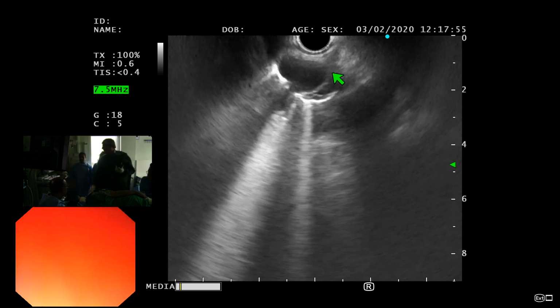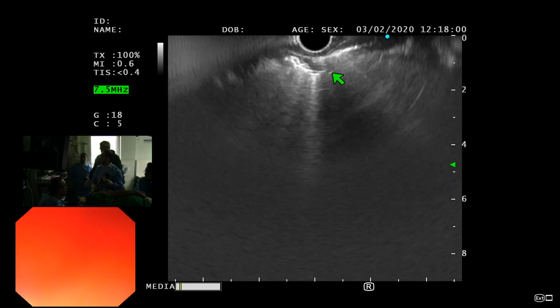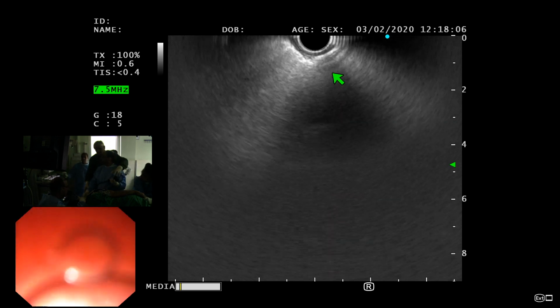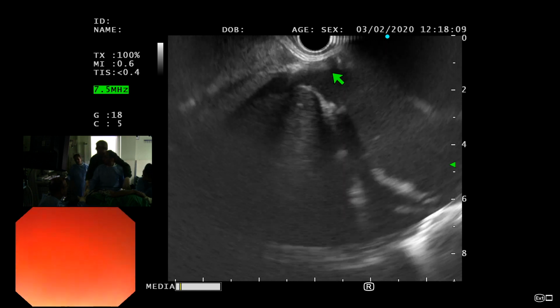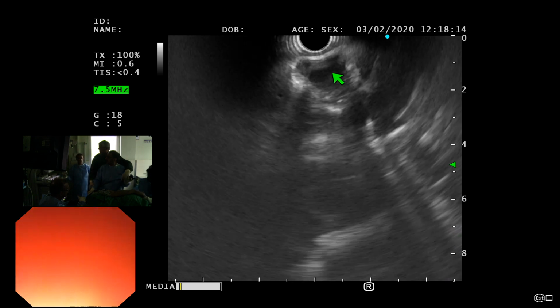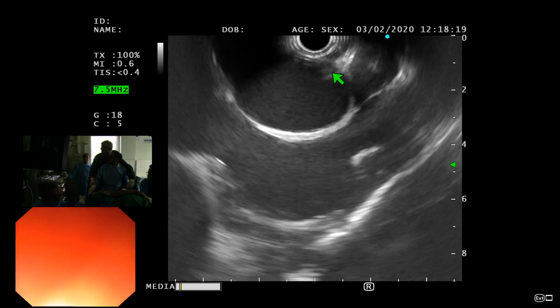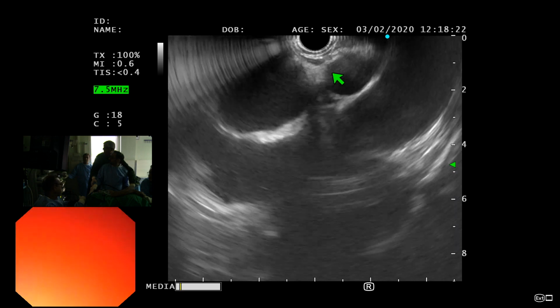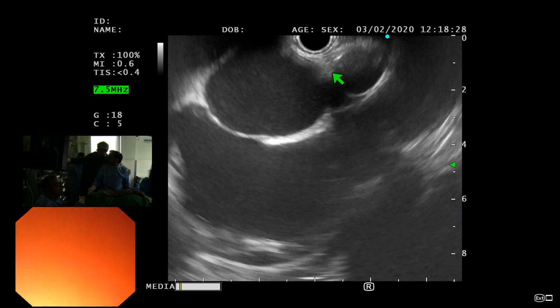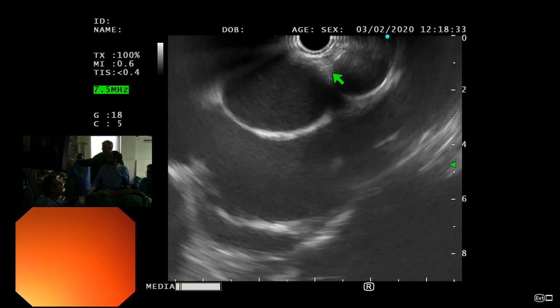Right, so today what I want you to do is just quickly come to 35. Okay, that's right, isn't it. Now let the scope go down, only the scope goes down. You got it. Now pull back a little, give a little clockwise, okay, just gentle, not too much, very light. Keep pulling back, keep going down, so you started seeing the valves. Okay. If you go in a little bit, this is your left atrium, that's your pulmonary artery, aorta, and this is the subcarina.